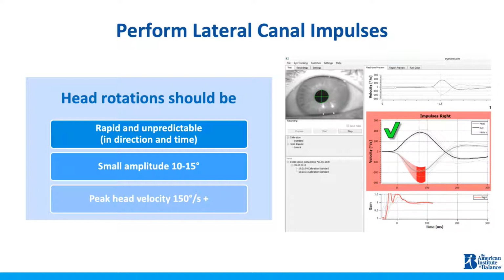You then decide, okay, I'm going to complete my comprehensive vestibular evaluation, including postural testing, the GANS SOP, video nystagmography or VNG, rotary chair testing, and calorics. What you find is that all your testing yielded normal results, with the exception of your caloric test, indicating a left unilateral caloric weakness. So from this sample case, what do you know about your patient's compensation status?